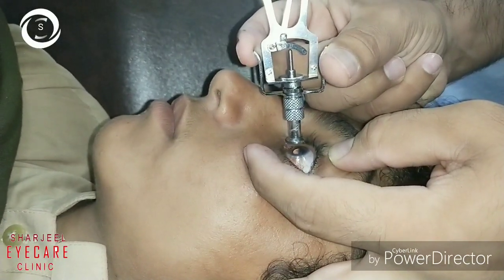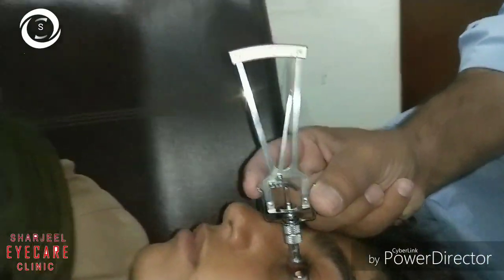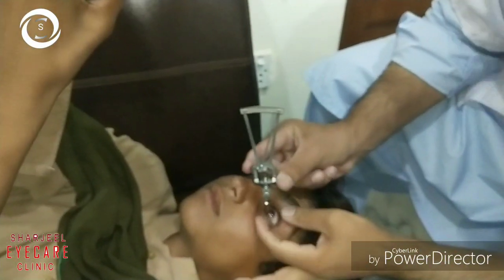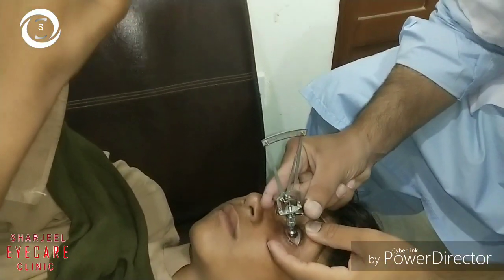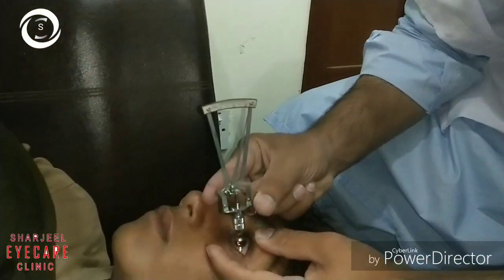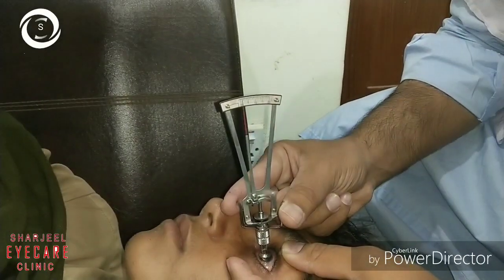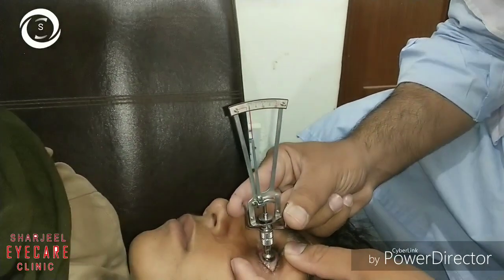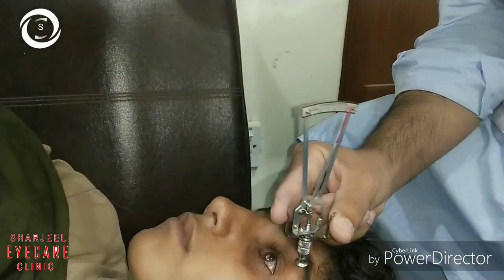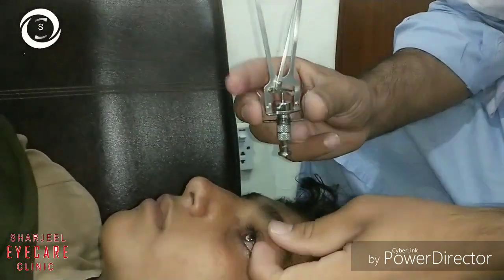This patient unfortunately had high intraocular pressure. When gently pressing on the cornea without weights, the needle is pointing to zero — confirmed six or seven times. All readings are at zero, indicating very high intraocular pressure.